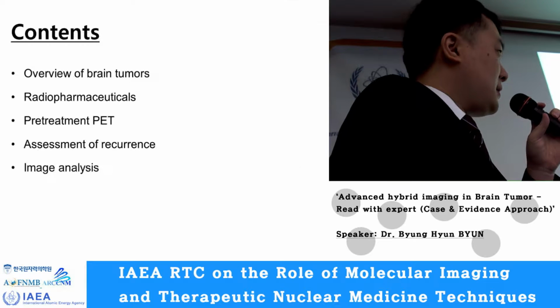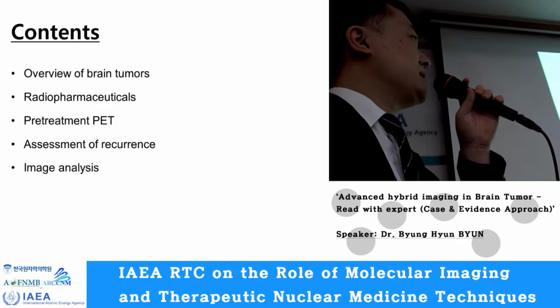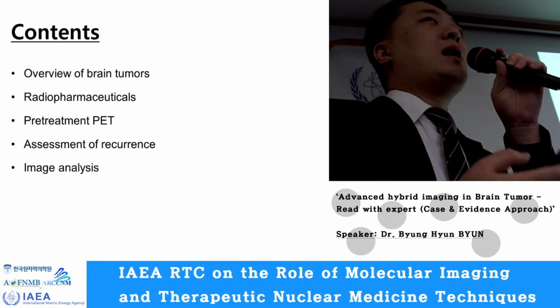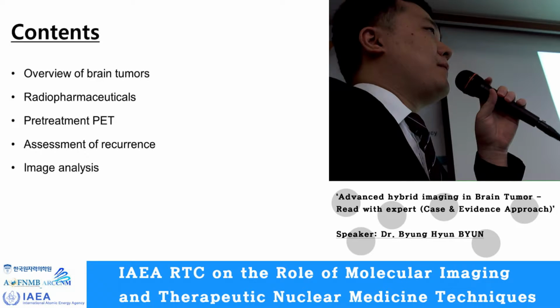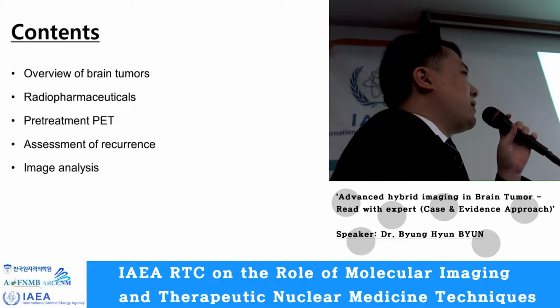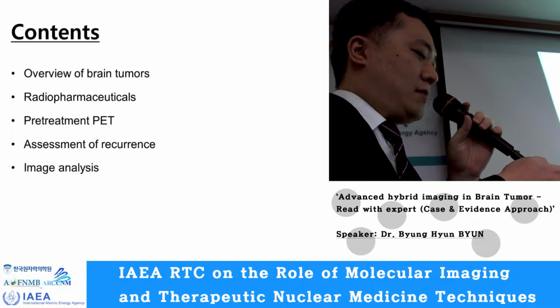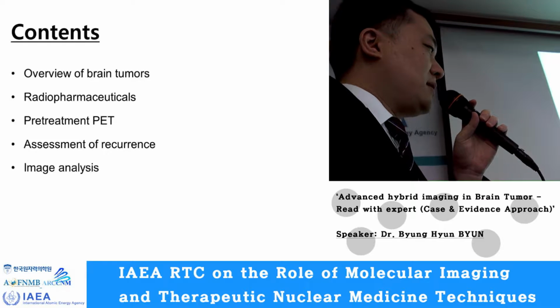I divided the presentation into several parts. The first is an overview of brain tumors, and the second is radiopharmaceuticals for brain PET and the usefulness of pre-treatment brain PET. Most importantly, the assessment of tumor recurrence, and finally, a brief comment on the image analysis of brain PET.